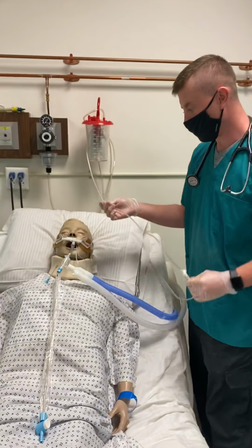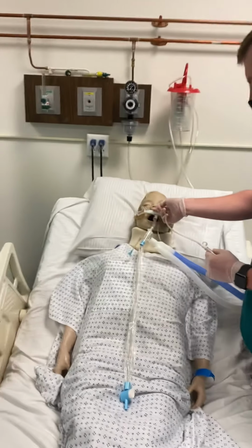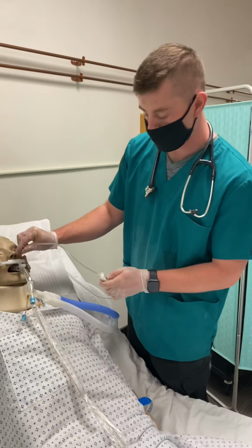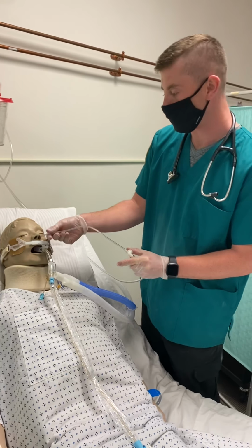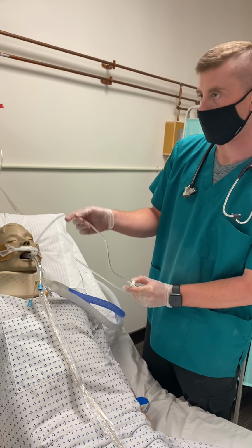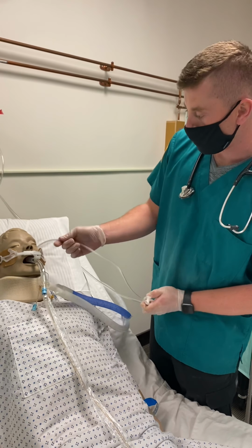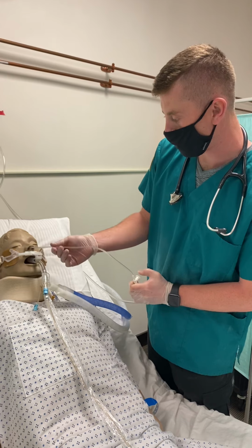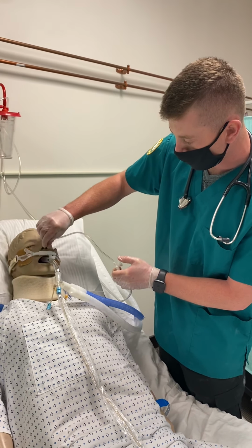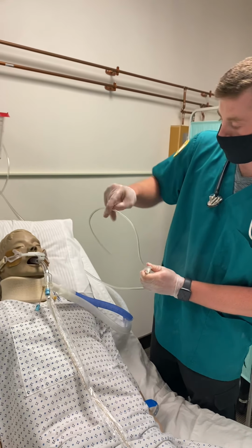Once that is applied, I would proceed to go in through the patient's nostrils until resistance is met or it causes a cough. And once a cough is caused, I would withdraw the suction catheter in 10 seconds or less, suctioning any secretions. Go through the other side as well, directing it down the patient's trachea. And once coughed, I withdraw the suction catheter.